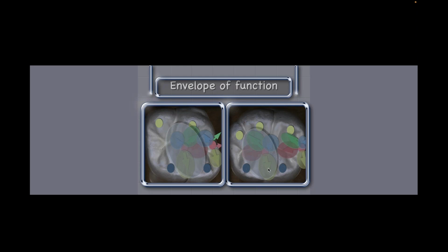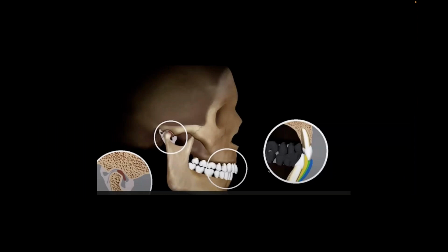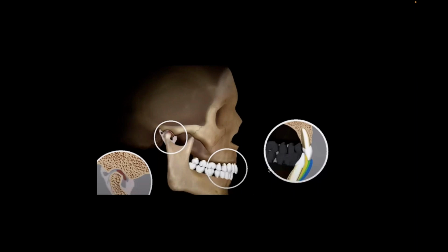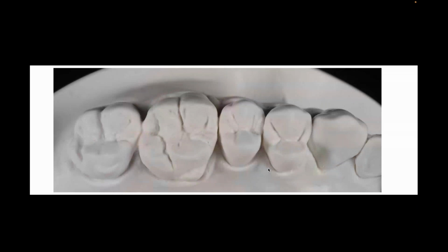And you can do some of that in the digital world. I'm not going to say you can't. But moving it in the digital world is only valuable to you if you understand what the digital world is showing you. So again, it goes back to the pencil and the drawing board rather than just diving in. The goal is to be able to think of the mastication process and how the patient is opening and closing and how the teeth are coming together as they work through the occlusal schemes. And your simple anatomy on a molar is what does that.